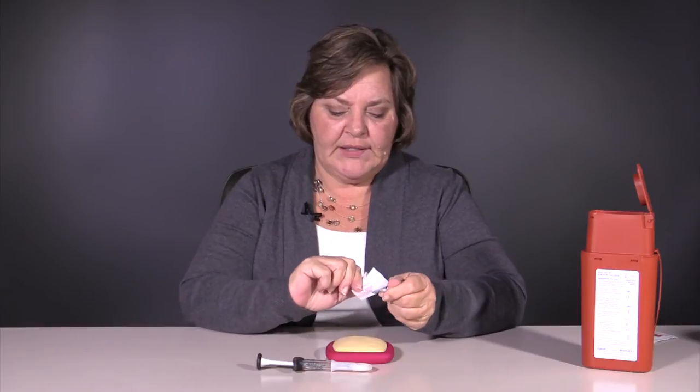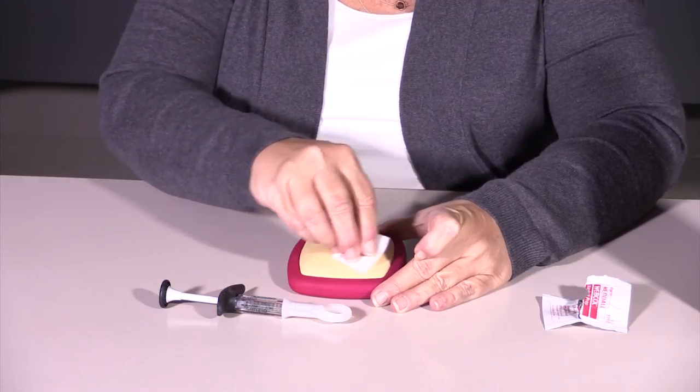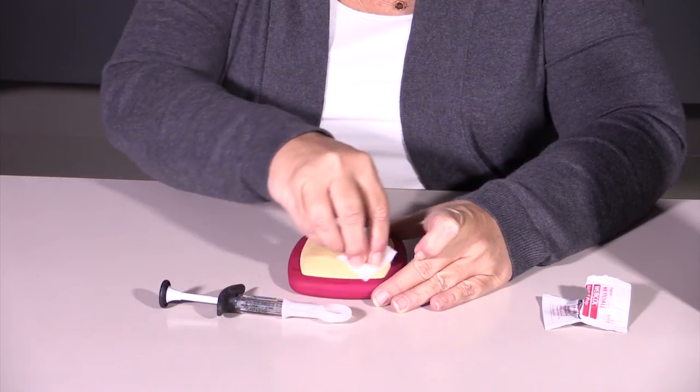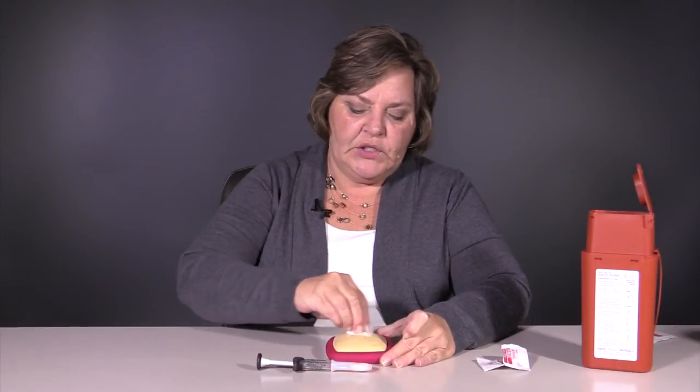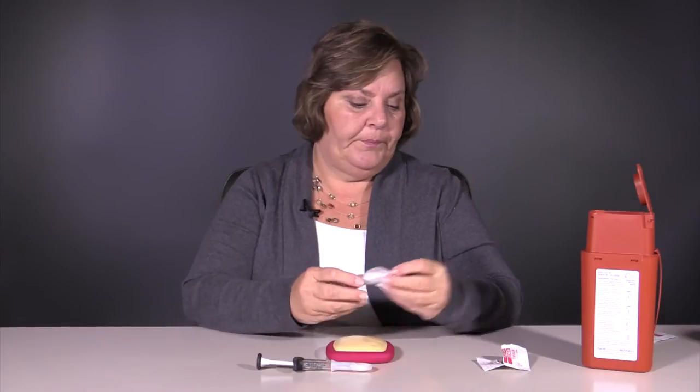The first thing we're going to do is prepare our skin. You're going to clean the area for about 30 seconds with your alcohol wipe, or your cotton ball and rubbing alcohol, just a circular motion on the area where you think you're going to do your injection, and then let that dry.